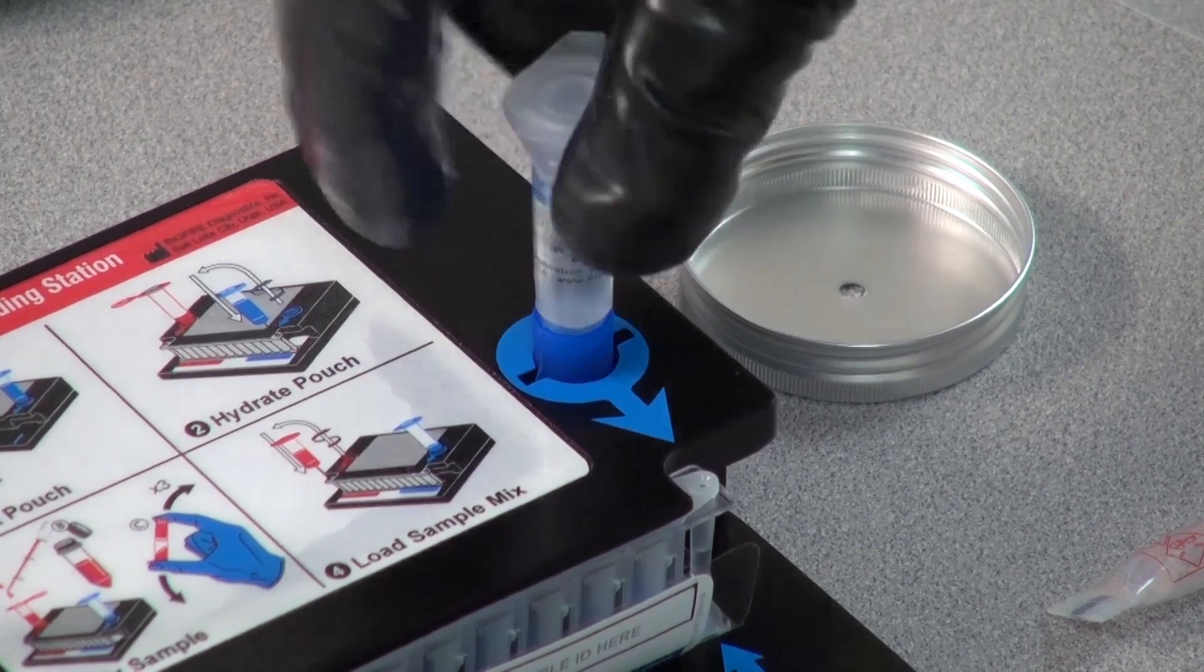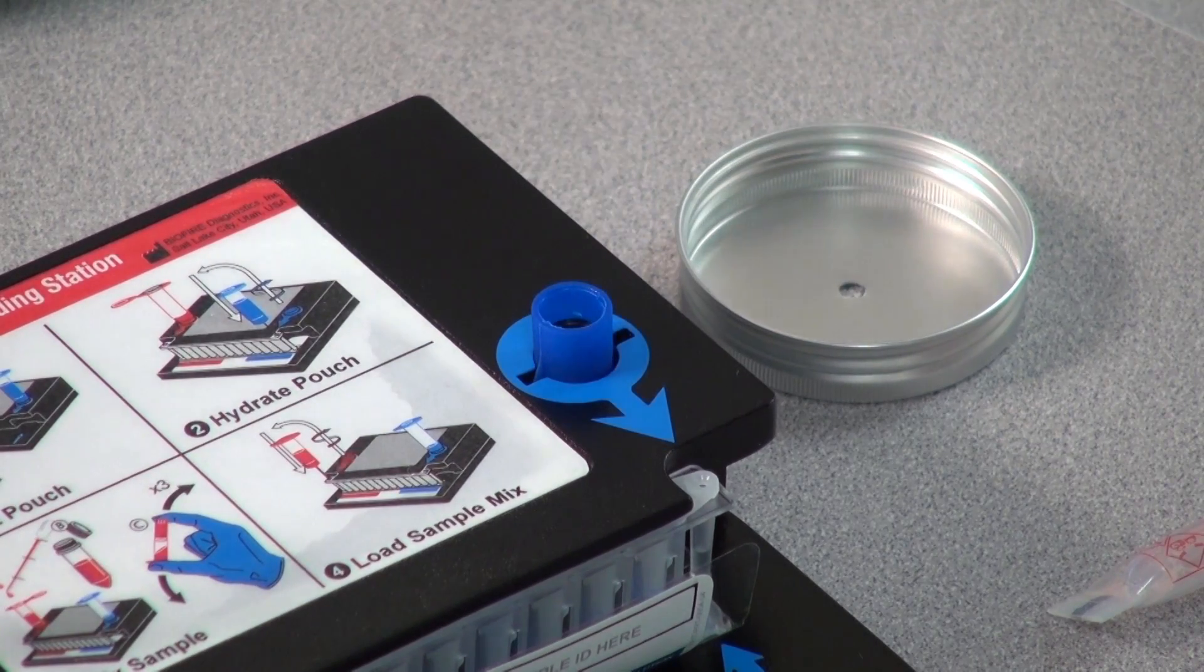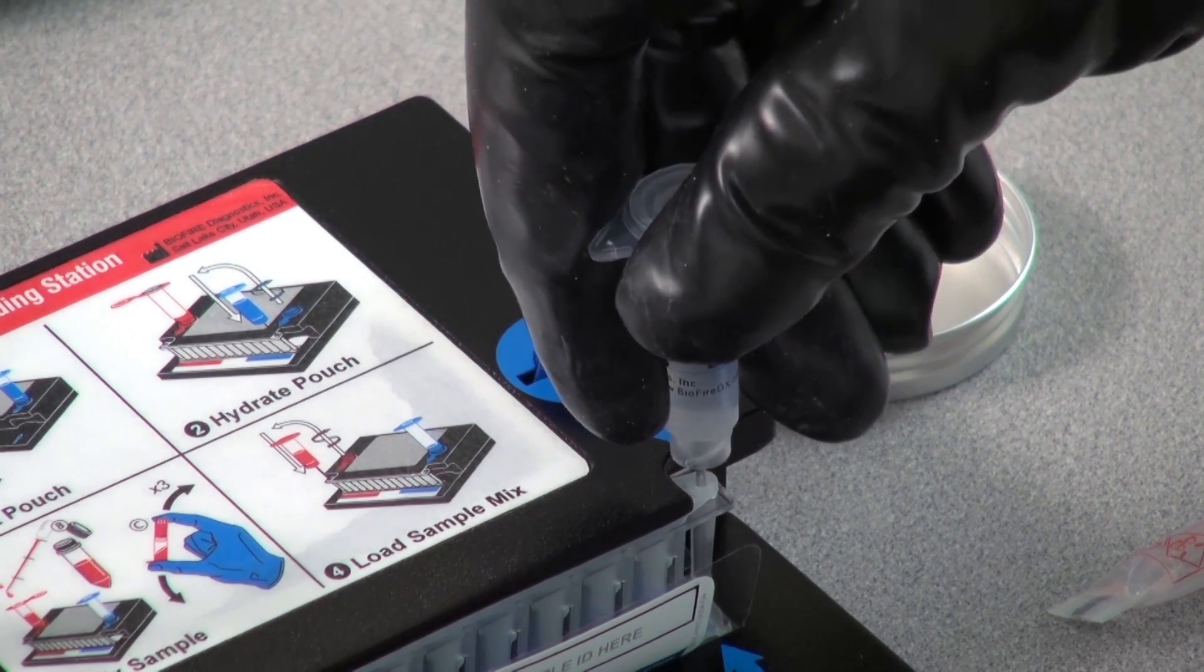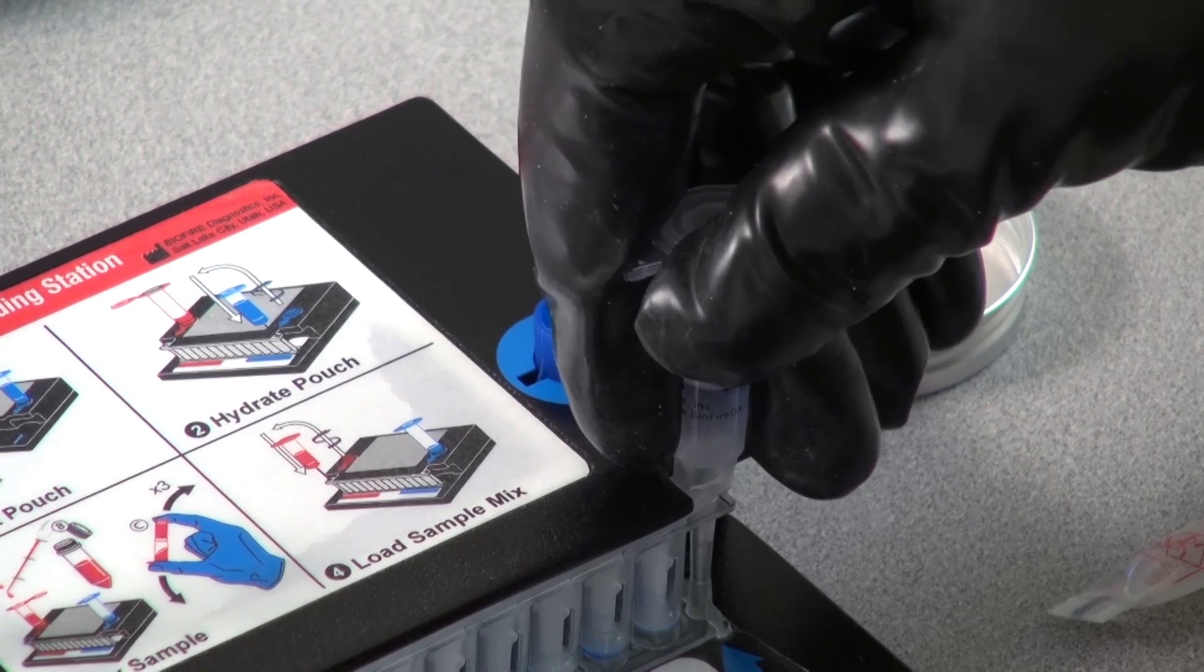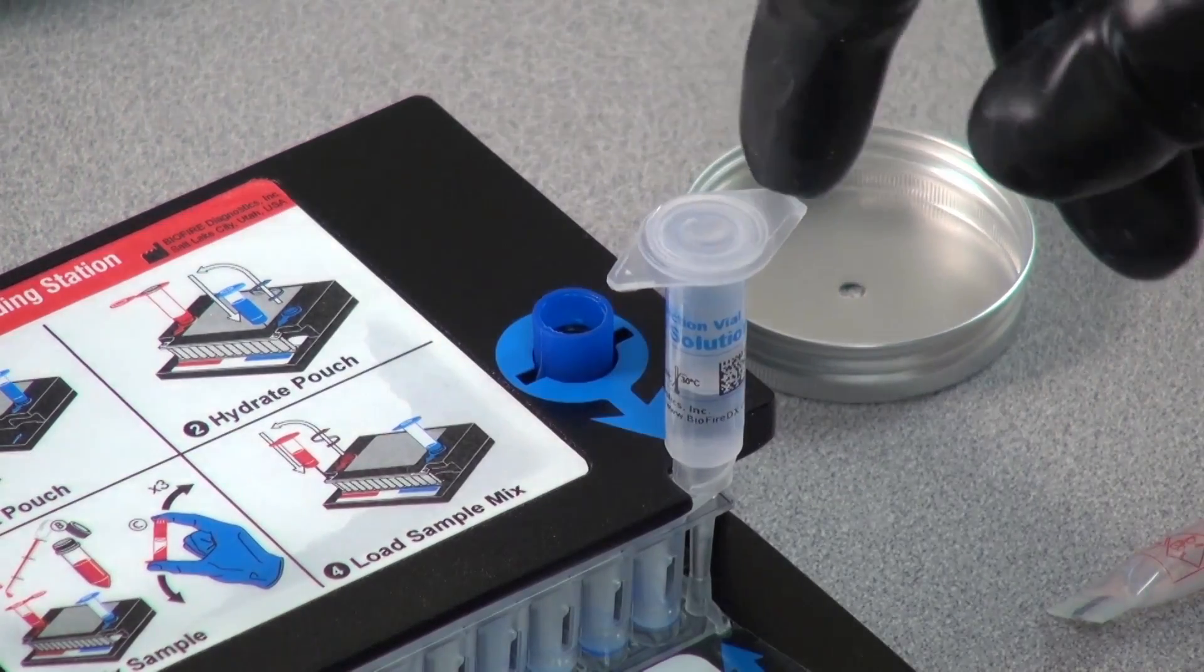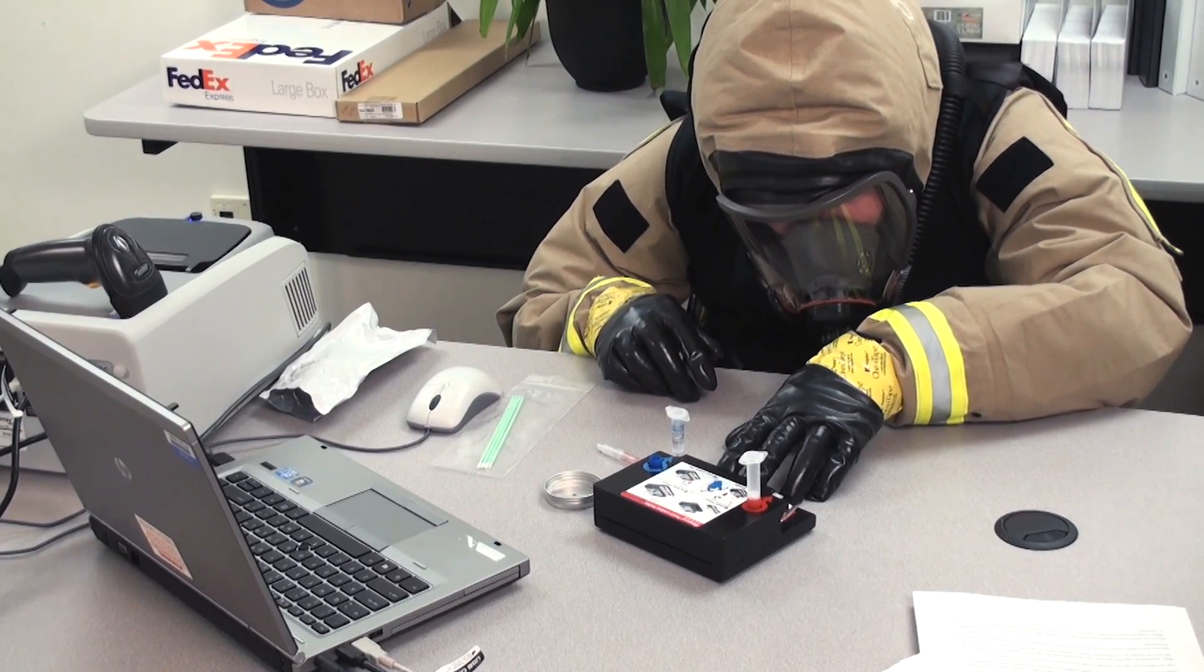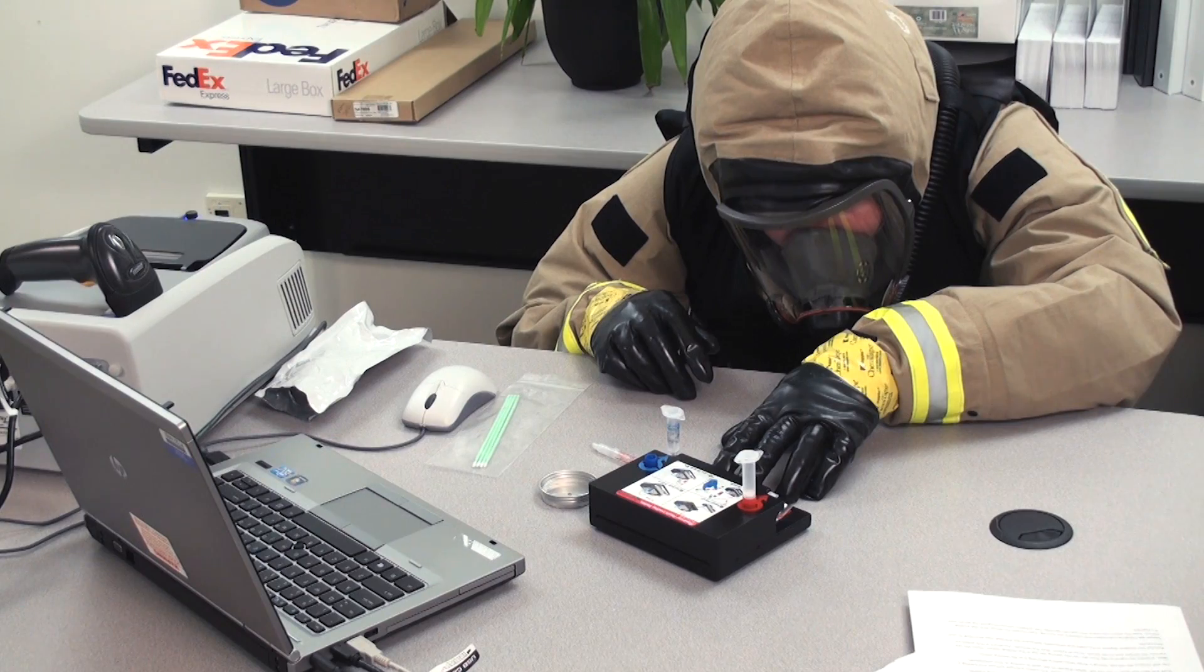Next, hydrate the pouch. Slowly unscrew and remove the blue vial, leaving the cap in the loading station. Insert the vial into the hydration port of the pouch and forcefully push down to break the seal. Wait 5 seconds for the solution to fill the pouch. Inspect to verify that all the reagent chambers are hydrated except the sample chamber on the left.